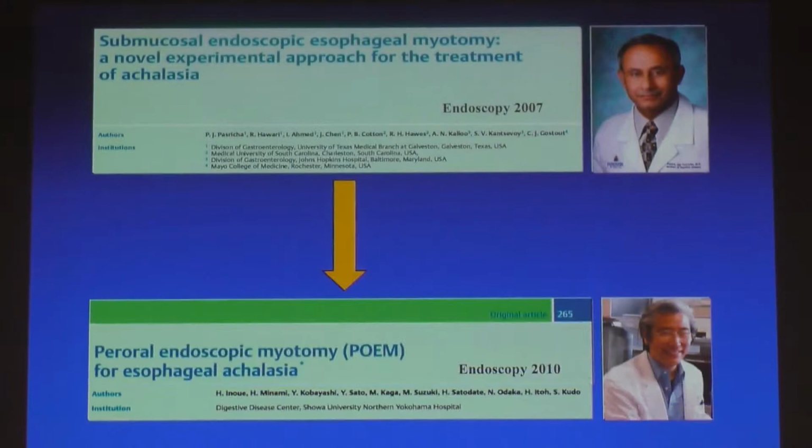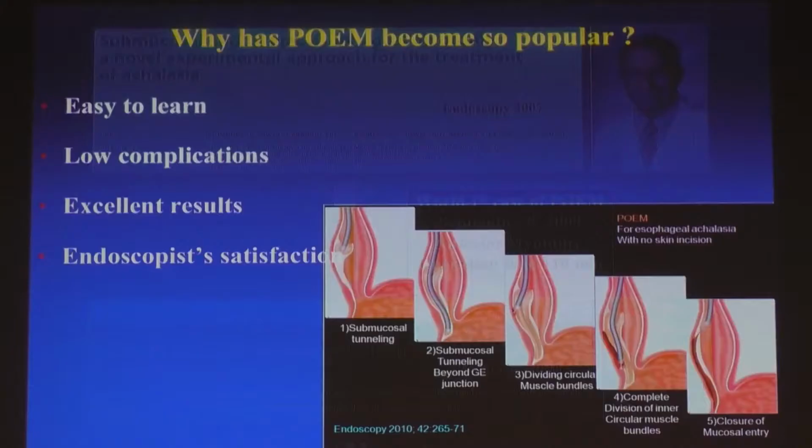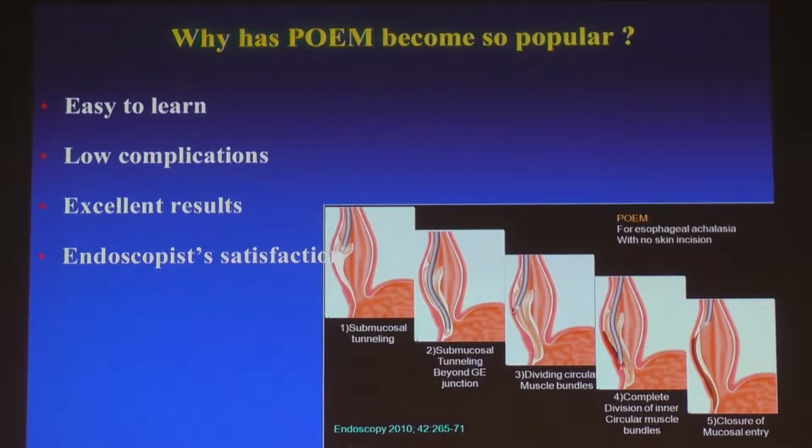Professor Haru Inoue conducted the world's first case of POEM, September 8, 2008. So now this year is the 10th anniversary of POEM. In the next paper, Professor Inoue introduced this 10 years history. So why has POEM become so popular? POEM is easy to learn, has low complications, excellent results, and also endoscopist satisfaction.